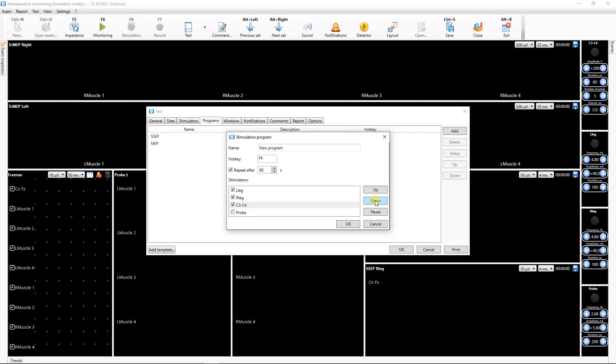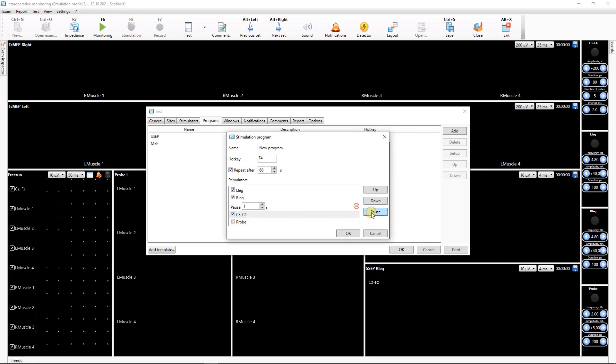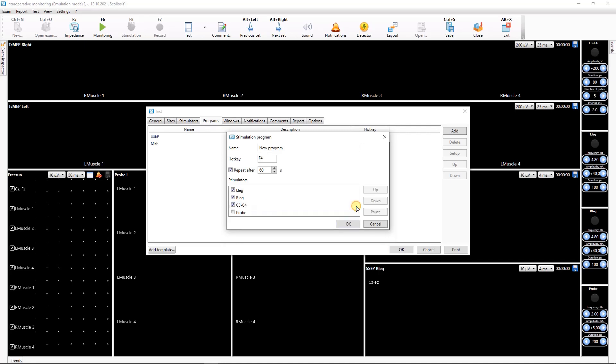Sometimes a pause in operation of two Stimulators is needed. To set the pause click the Stimulator before which the pause is required and press Pause button. Specify the desired pause duration in seconds in the appeared textbox. To delete the pause click the red cross in the Pause field.